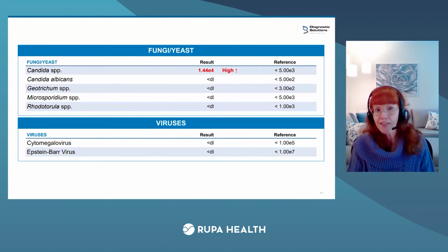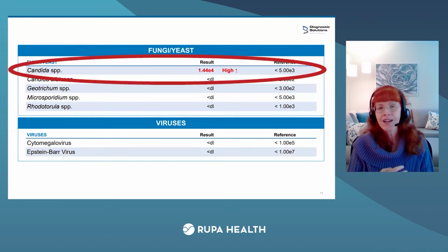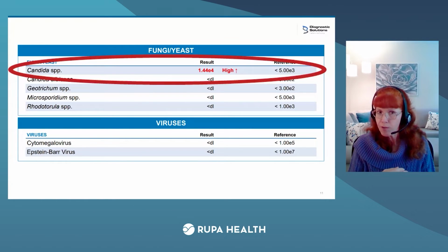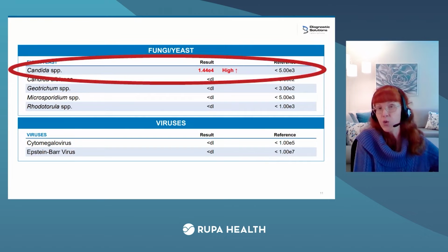Now, we next look at the yeast section, and sure enough, we do have some candida overgrowth as well. Not a surprise given what we've seen so far. Now, again, it's all about the terrain, the environment. What does candida like? It loves H. pylori's help in making that colonic pH and the intestinal pH a little bit higher, on the alkaline side. So yeast will really thrive when the pH isn't kept where it should be kept. Again, H. pylori is probably like a primary issue here, and now we're seeing all the fallout, the consequences of what it's doing, suppressing the stomach acid and affecting digestion.